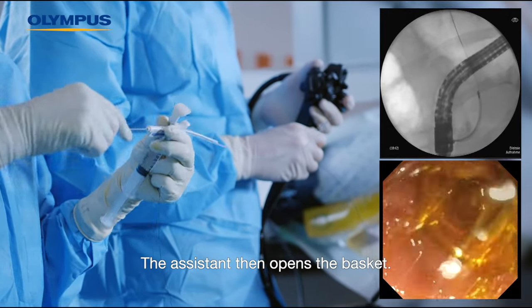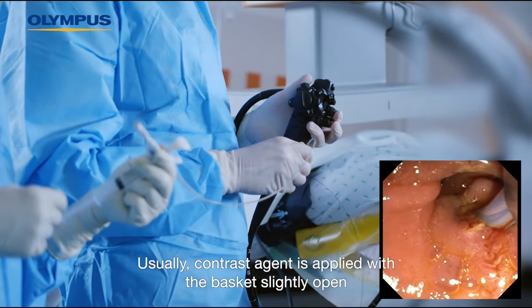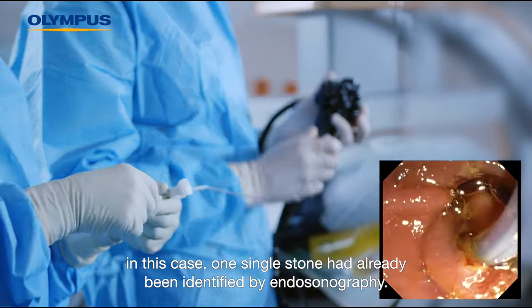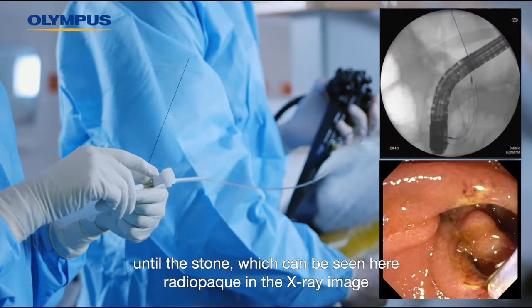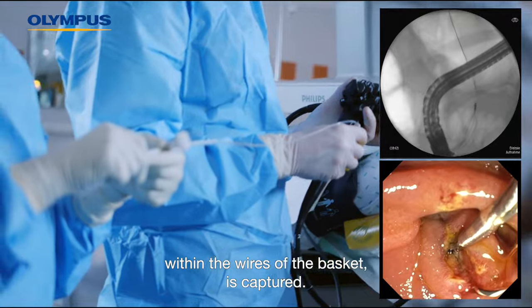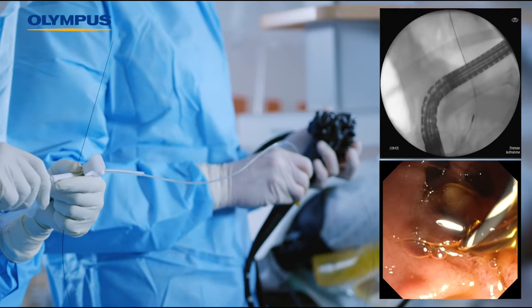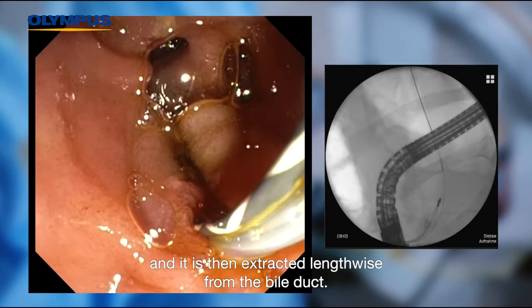The assistant then opens the basket. Usually, contrast agent is applied with the basket slightly open to show the stone. In this case, one single stone had already been identified by endosonography. The basket can thus be fully opened and is pulled all the way through the bile duct until the stone, which can be seen here radiopaque in the x-ray image within the wires of the basket, is captured. The basket is closed a little until it has a firm hold of the stone and is then extracted lengthwise from the bile duct.